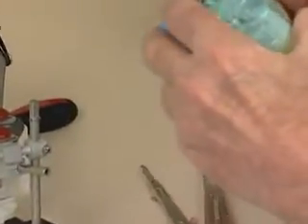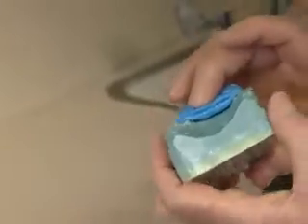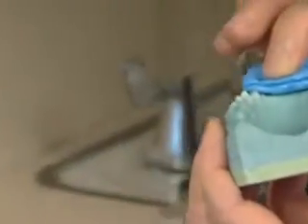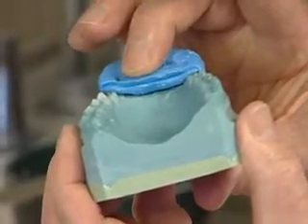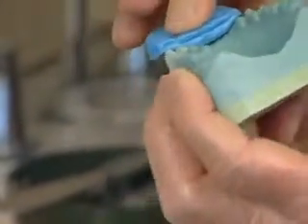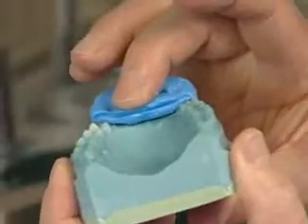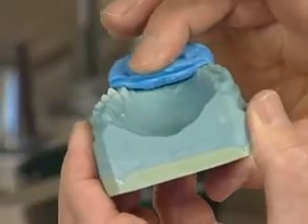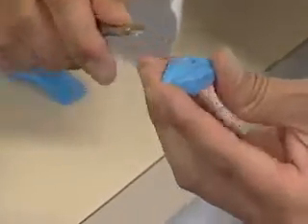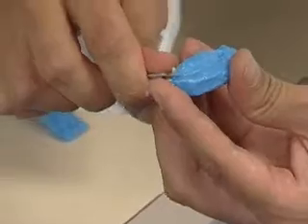He can take his blue wax bites now and put on the model to make sure they're fitting the model good. Now what's critical here, make sure the blue wax is not touching soft tissue anywhere. If there's any doubt in your mind, as you look here, you trim away the blue wax so that it's very clearly clearing the soft tissue.